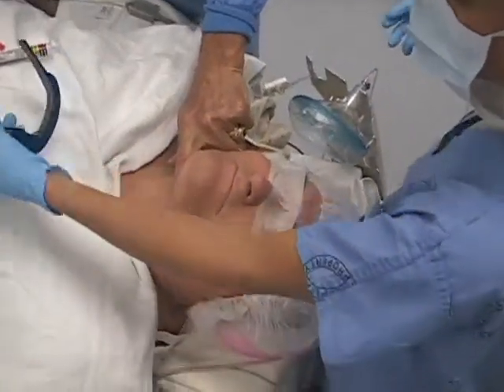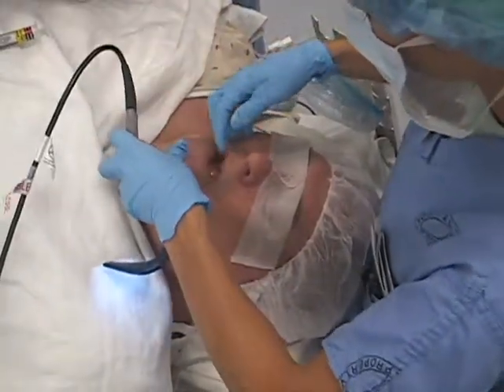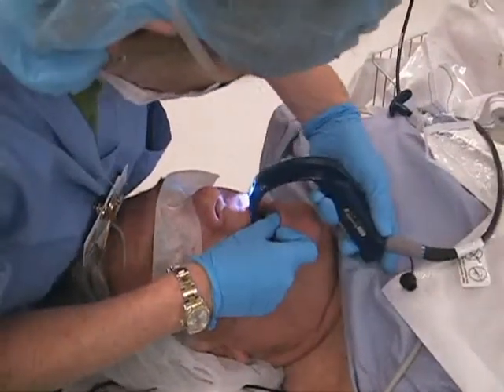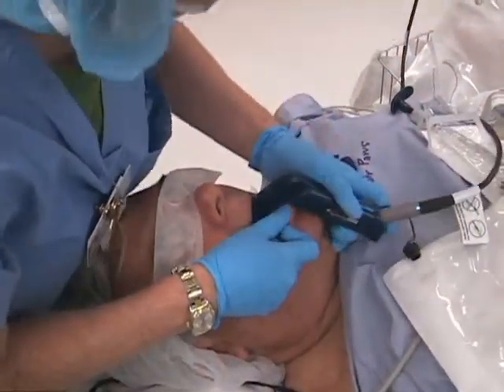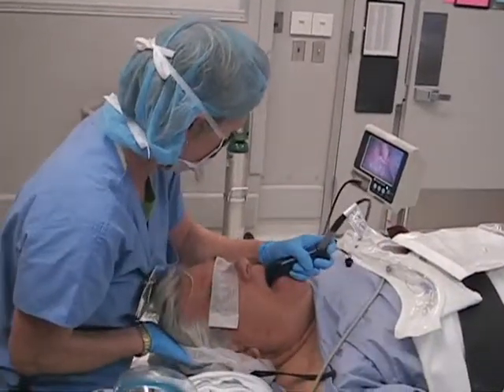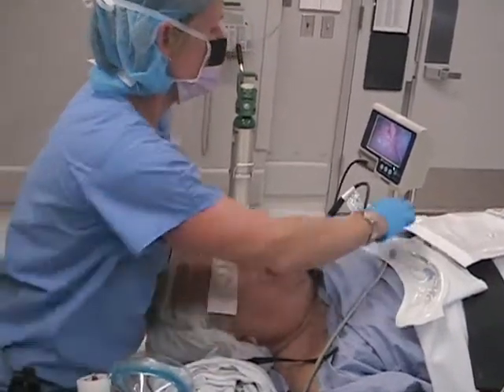The GlideScope video laryngoscope is an extremely useful tool for intubating the patient with a challenging airway, because it allows the intubator to essentially see around the corner into the posterior pharynx. This image is then projected on a monitor where not only the intubator but his or her assistants can see it.